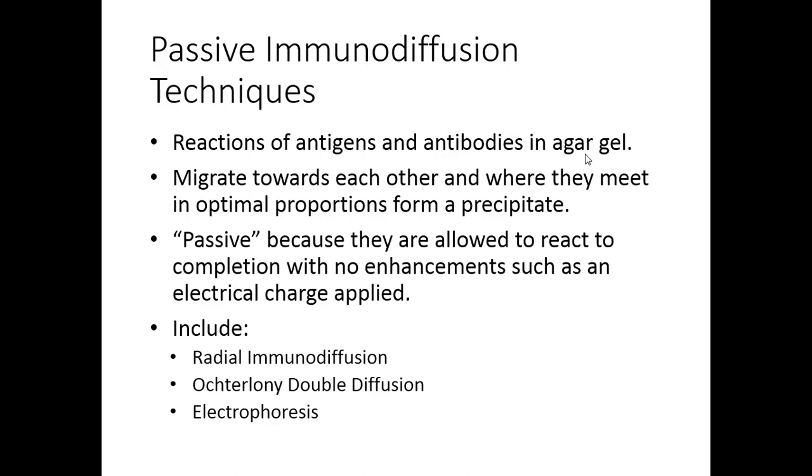Antibodies and antigens diffuse. They're inoculated into the gel, and they migrate towards each other, as two things that are opposites are prone to do.